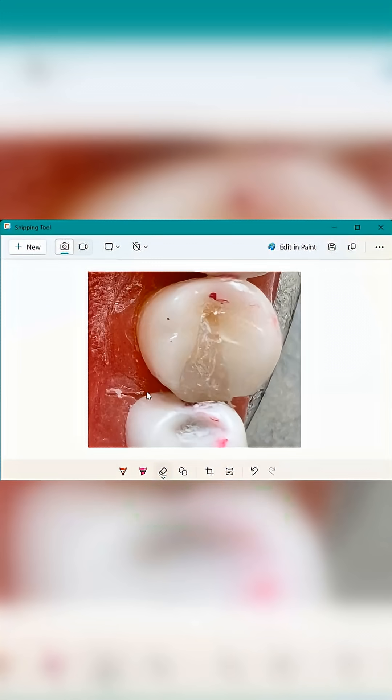So this is not good — you're going to get deductions from this. Also, your gingiva is all torn up. I know this is probably a very used-up typodont, but just be aware of these things. So let's work on the shape and the finish.